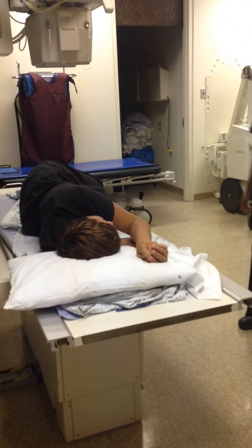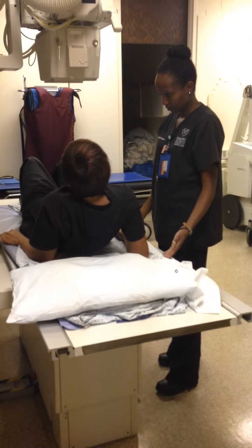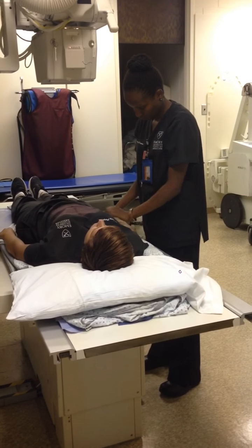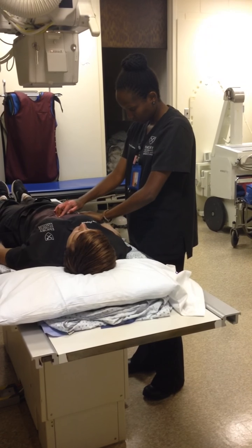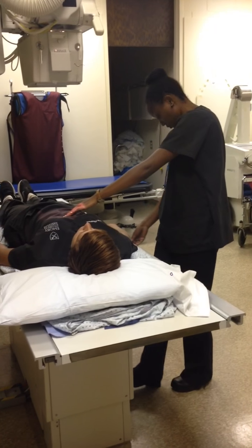The last projection is the AP projection of the stomach. The purpose of this projection is to see the fundus of the stomach filled with barium. Have the patient roll and lay in the supine position. The patient's arms and shoulders will be slightly abducted away from their side with their pelvis and hips in the same plane to ensure that the patient is not tilted or rotated.